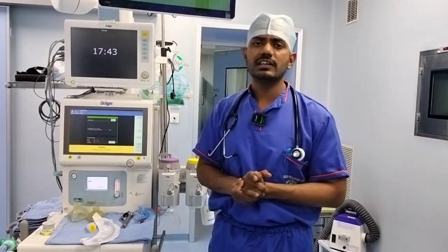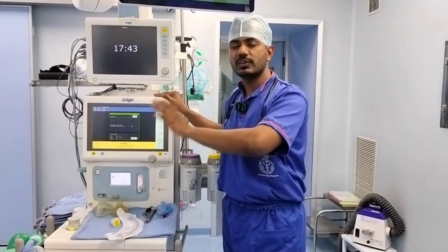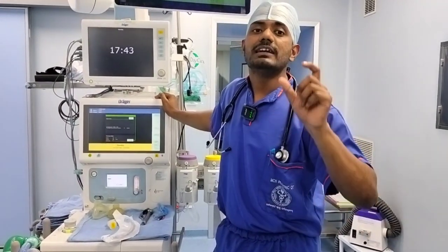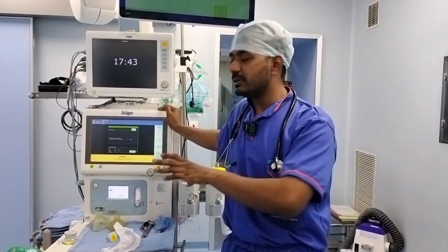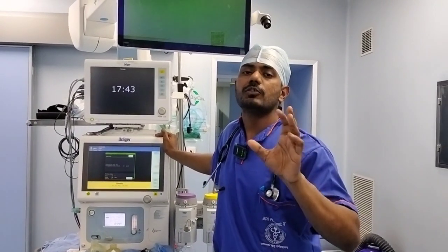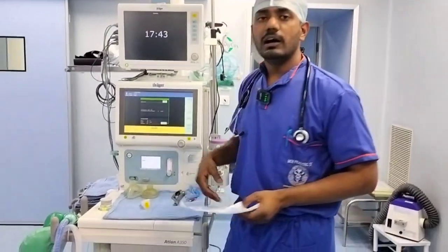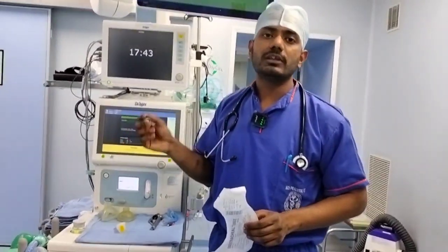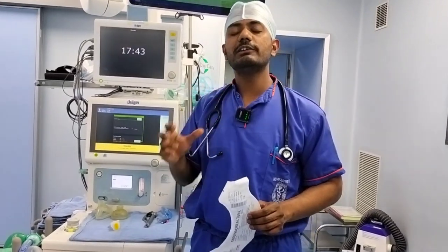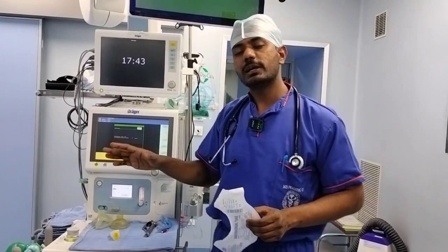So how is it significant? It's not a big deal to have a ventilator which functions, and a patient's lungs which are damaged. But establishing the connection between the patient's lungs and the ventilator is by itself an art, which is usually done by the anesthetist. Andreas Vesalius, in 1543, passed a reed into the trachea of an animal. Then he was able to ventilate the animal and he saved that animal. That's how it became so popular.